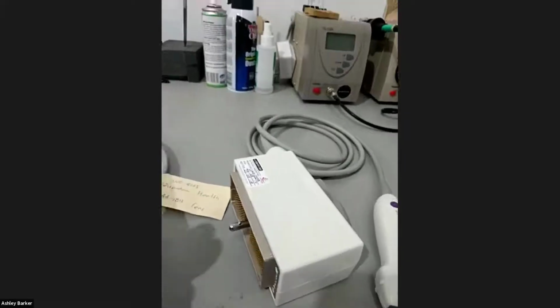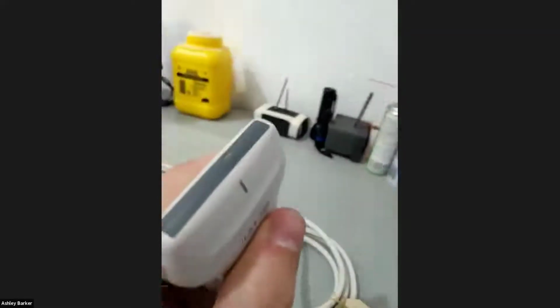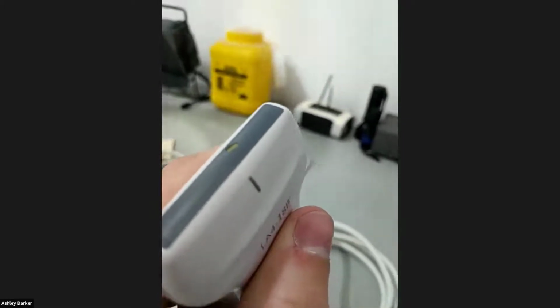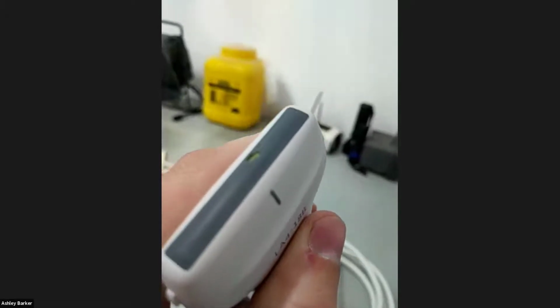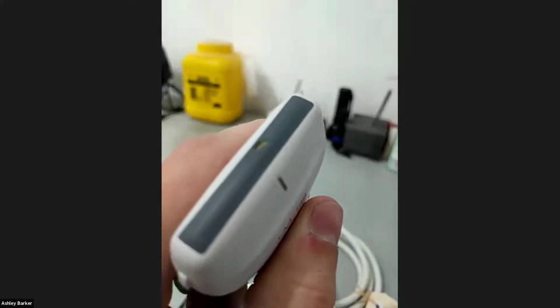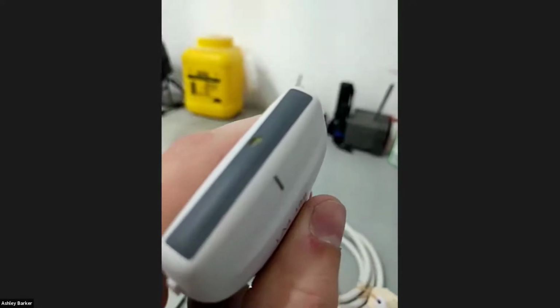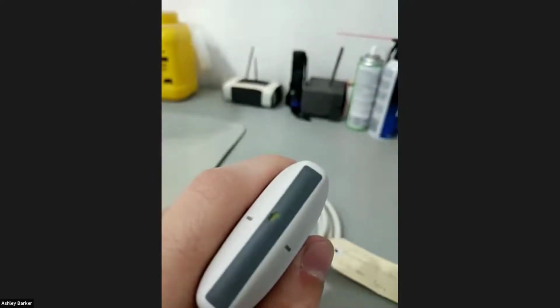This one here is again lens damage, and let's see, I don't know if that's visible there. Are you guys able to see that? Yeah. So that one's a bit less obvious to see, but basically you can see that there's a little nick out of it, and that's really common. We see that all the time when we go through clinics and do probe testing for people, and there's so many probes like that that people just haven't noticed. And it is an electrical safety hazard.